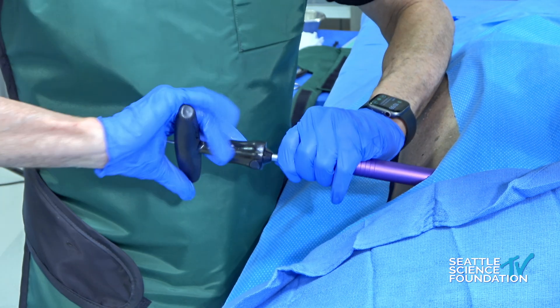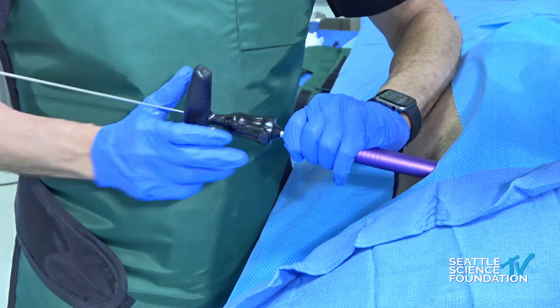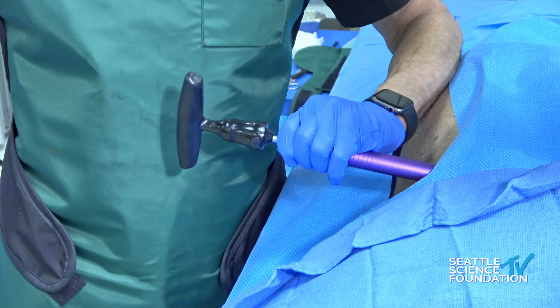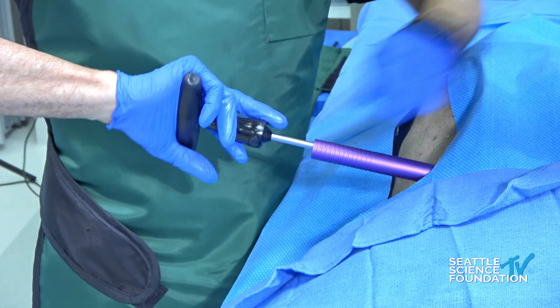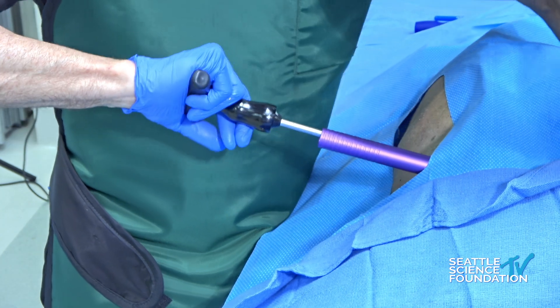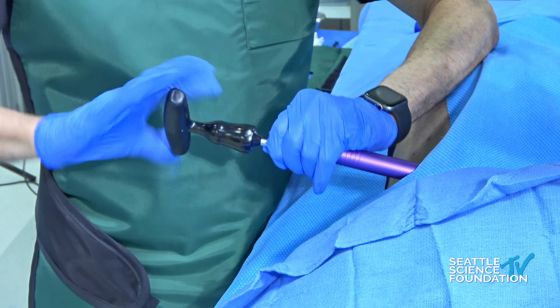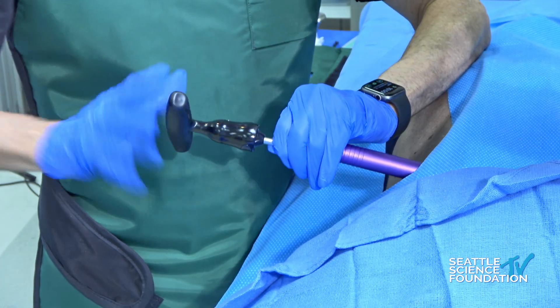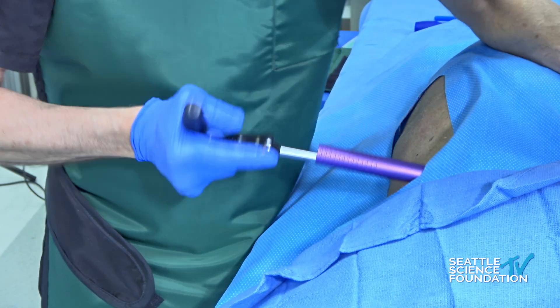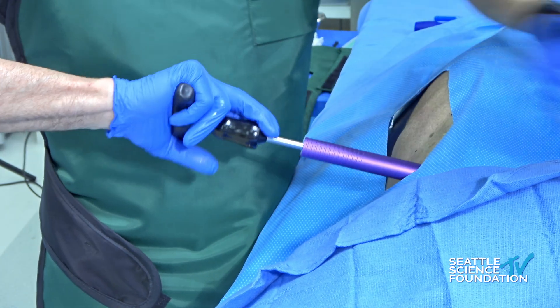It will also decorticate the cortices on the spinous process. I'm going to remove the wire at this point. As soon as the tip gets to the contralateral lamina, you can remove that wire. Don't remove it before, when the tip is in the interspinous space. Doug, is this the point in the procedure where you regret not having become an orthopedic surgeon? Exactly.